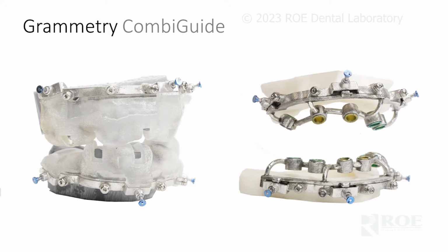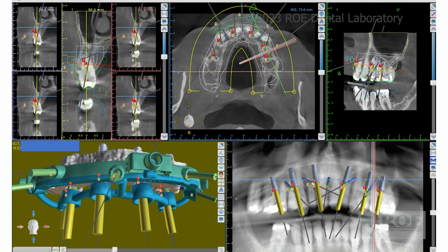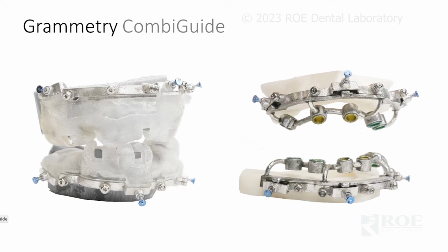All right, so let's just go through this process. Just like with all surgical guides, we need a CT scan. We need preoperative records. It'd be nice to have a CR bite, but really we mostly get CO, and then we open the bite, or we do a little back and forth with you to work out the bite. Some photographs, and then off we go to planning. We'll plan the case with you, make sure all the implants are in the right positions, and that you're happy with the whole plan. Then we will send you the case. This is what shows up: pin guide, fixation base, osteotomy guide. Real simple.